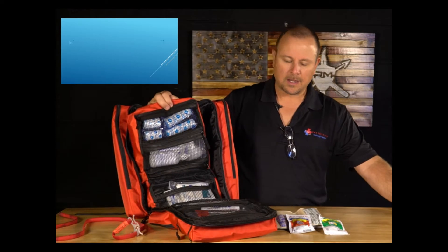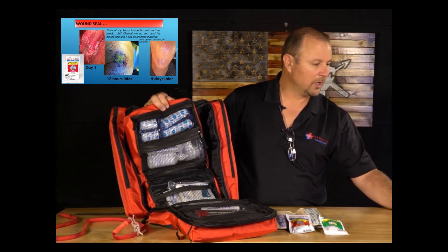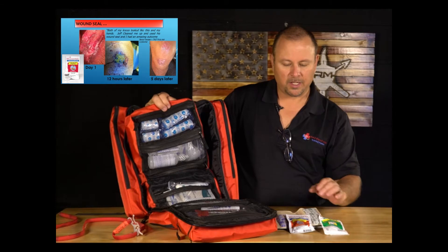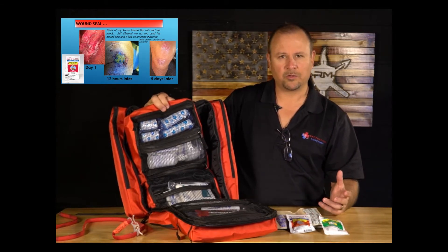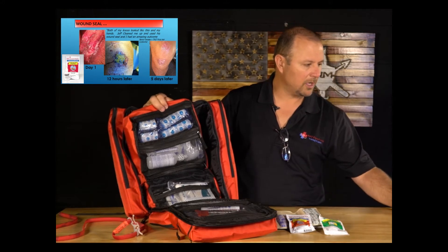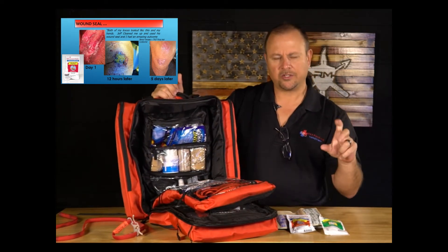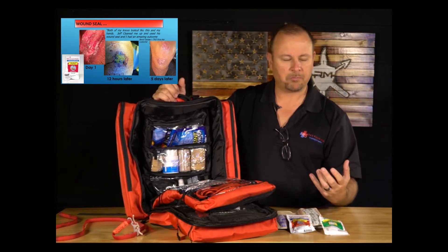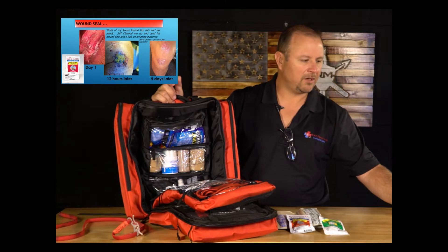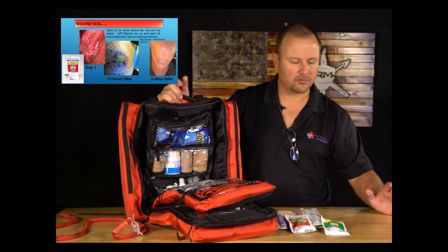Here are some case study slides. The first is a knee laceration — really an avulsion where all the tissue was removed. I spent a lot of time picking out gravel, cleaning it well, then used wound seal. There needs to be blood present for wound seal to bind — otherwise it stays powder. In this case, there wasn't much blood, so I used a little antiseptic spray as the liquid. The middle image is 12 hours after wound seal was applied; the last image is the knee five days later with no sign of infection.